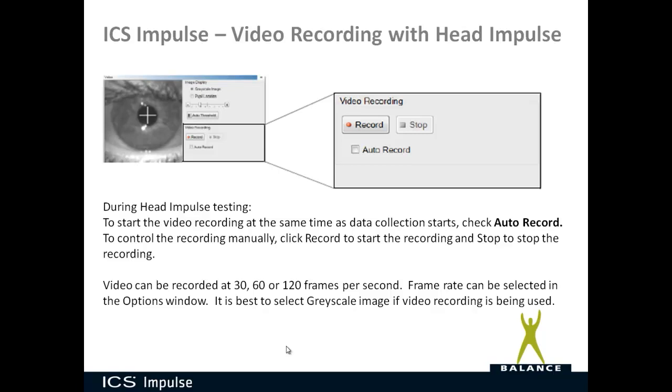To start the video recording at the same time as data collection, you want to make sure the auto record box is checked. To control the video recording manually, you can click record to start the recording and stop to stop the recording.